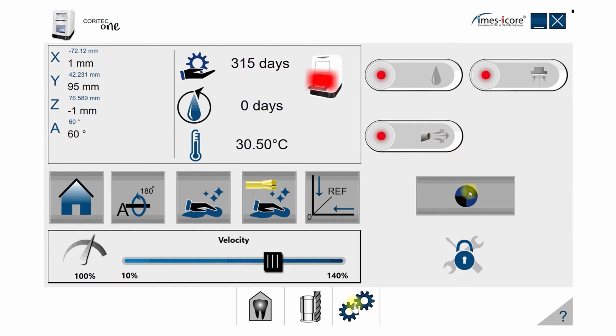The next button is represented by a Secchi disc, which looks like a circle with 2 dark colored quadrants and 2 light colored quadrants. This button will allow you to input the measurements from the calibration test specimen. Next, we have an admin tools button that is only accessible with an admin password for the machine. We don't allow end users to access this area to prevent them from damaging the machine.